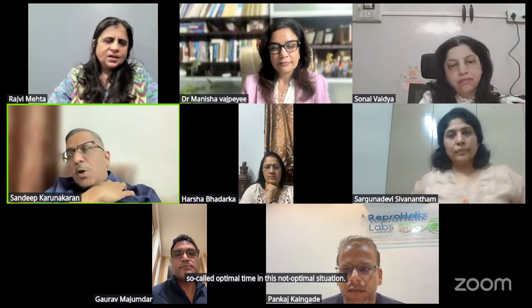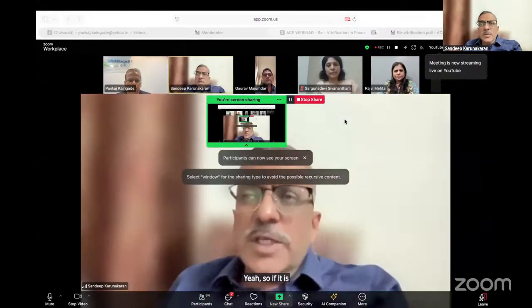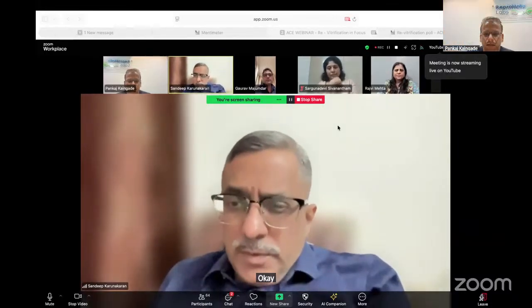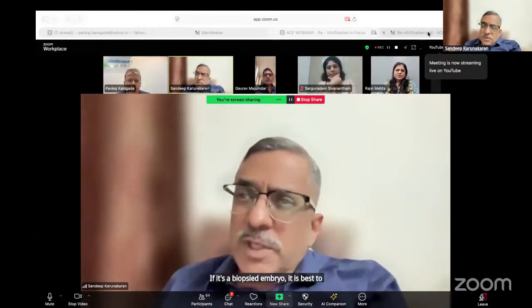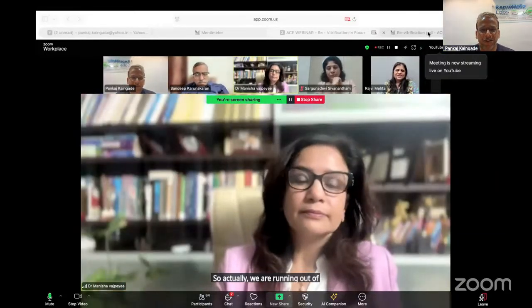If it is not a biopsied embryo, talking of a normal embryo, then I would wait for the first hint of life before vitrification. If it's a biopsied embryo, it is best to start the process immediately. Immediately. So actually we are running out of time, so we'll directly move on to the poll.